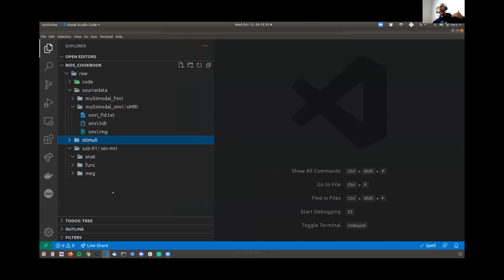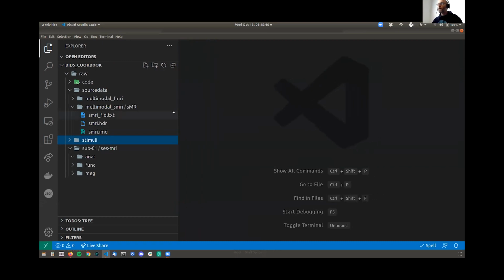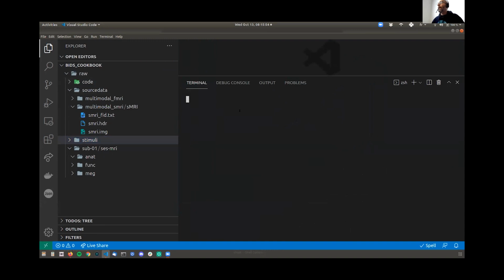Very often when you have neuroimaging data, it comes out of the scanner as what's called DICOM data. Here, this is a bit different. It's an old data set from SPM, so this is a file format you might encounter, but more if you're going to dig into old data sets. I'm also doing it here with this type of data so that you can see that BIDS can adapt around whatever input file format you have, and you can still do it.